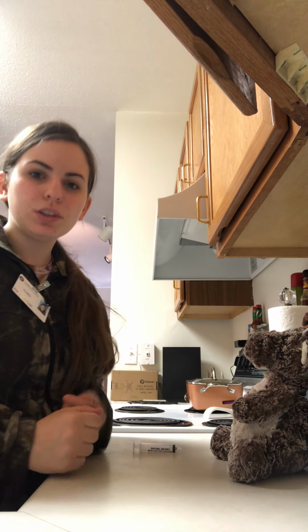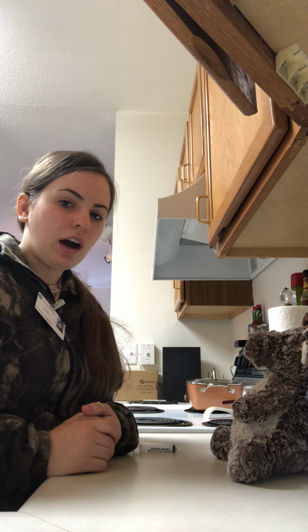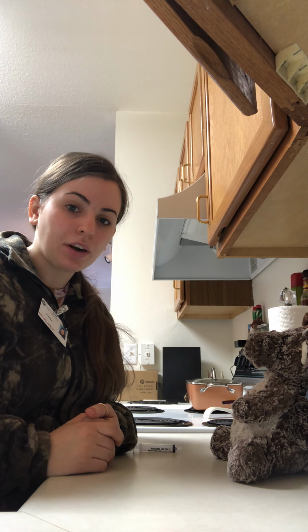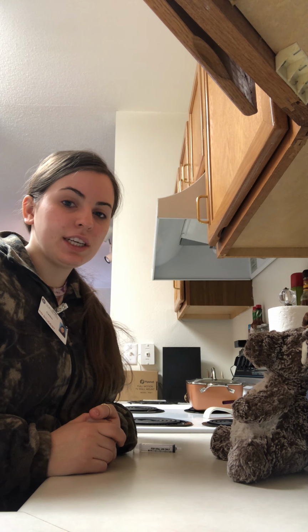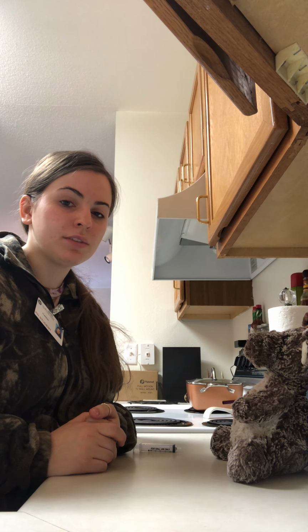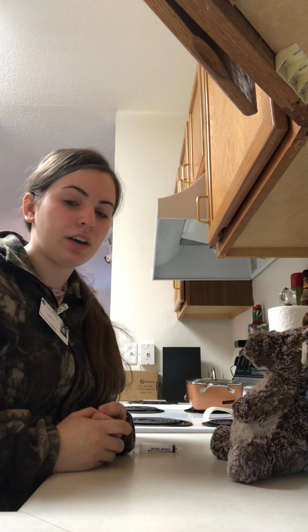Right, so we have our patient, Mr. Moose here. He received 1 unit of packed red blood cells earlier, and I noticed he had increased shortness of breath and fine crackles bilaterally, so I notified the doctor. The doctor ordered 40 milligrams of Lasix via IV, and I have 10 milligrams of Lasix per 1 mL available to me, so I will give 4 mL of Lasix via IV for Mr. Moose.